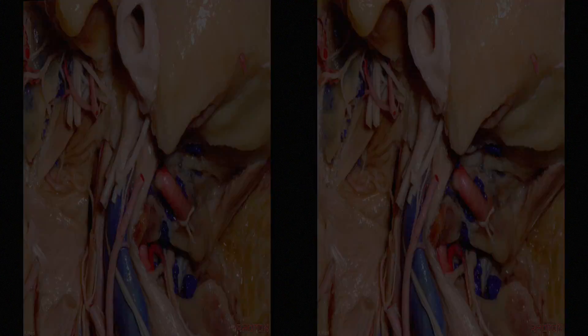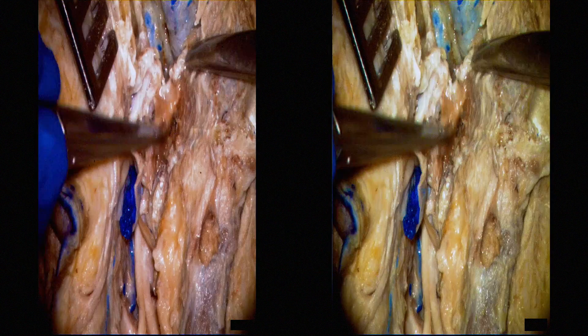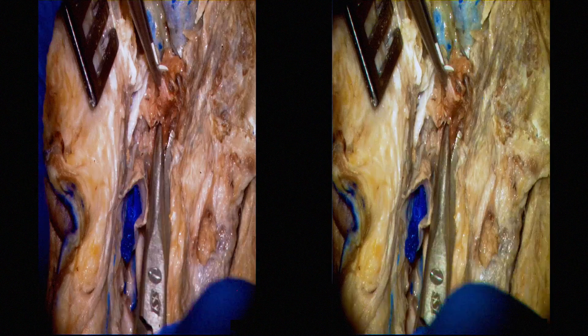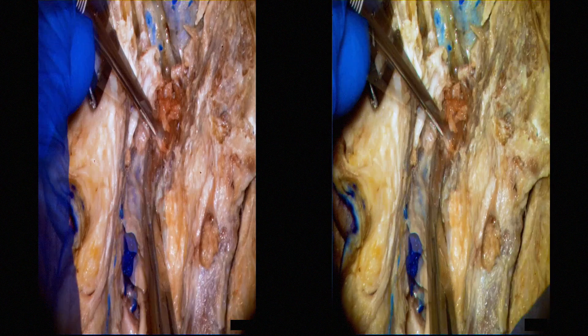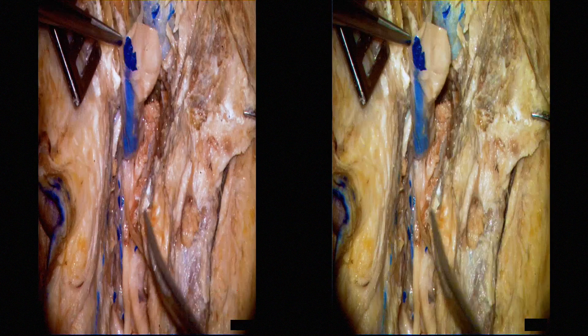The transverse process of C1 is defined. The rectus capitis lateralis muscle is sharply dissected from the superior margin of the transverse process of C1 and removed in a piecemeal fashion to the posterior margin of the jugular foramen. Removal of this muscle is necessary to expose the posterior margin of the jugular foramen. As one removes it, care must be taken to avoid the vertebral artery, which exits the foramen transversarium posterior medial to the muscle. Here we see the venous plexus associated with the vertebral artery. The lower cranial nerves are then separated from the jugular vein to the level of the jugular foramen.